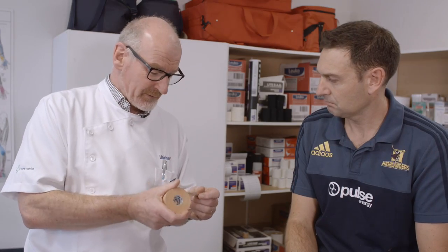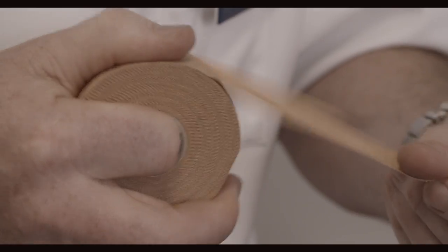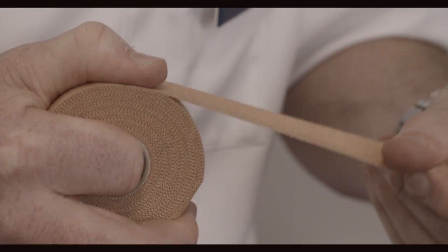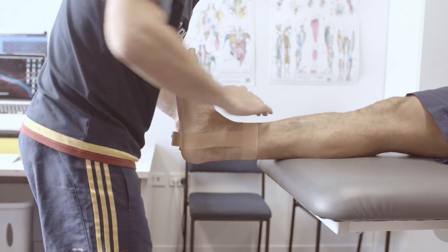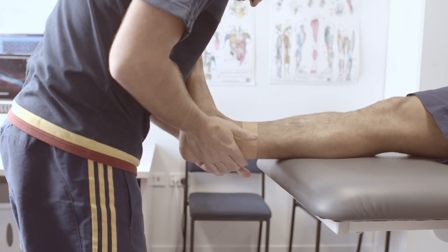So Adam, this is the rigid tape — obviously it doesn't stretch, so this is for the more serious injuries? Yeah, this is probably the product I use the most. It's a zinc oxide tape, it's made of more rigid cotton so it's a lot firmer. It is tearable as well, which makes it useful, and it has a zinc oxide adhesive so it sticks really well.